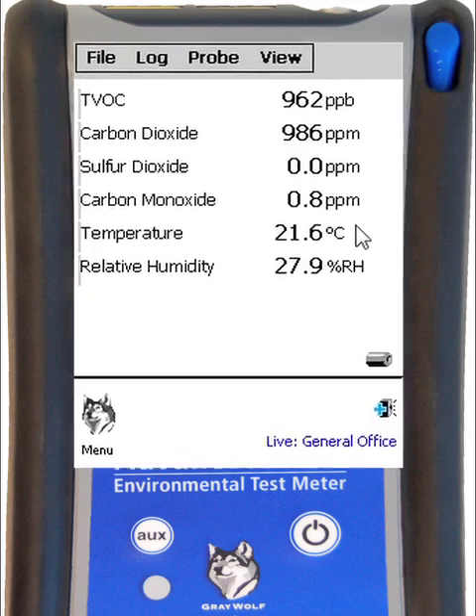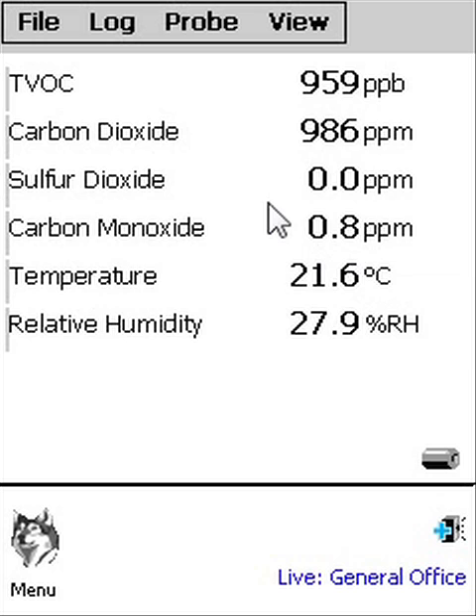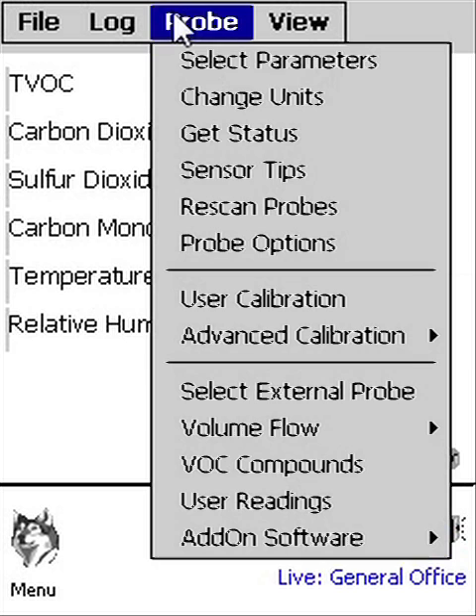This is what the calibration screens look like on GreyWolf Meters when you perform a user calibration. Select Probe, then User Calibration from the top menu.